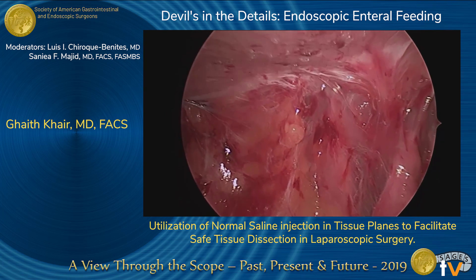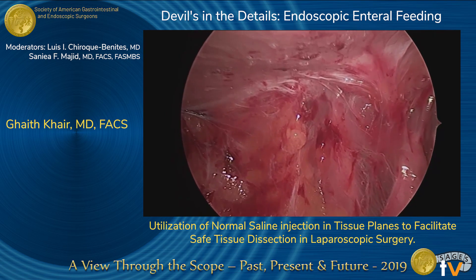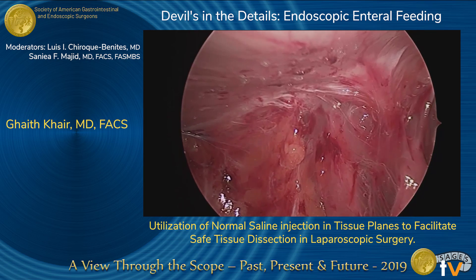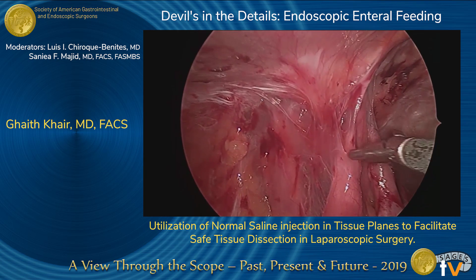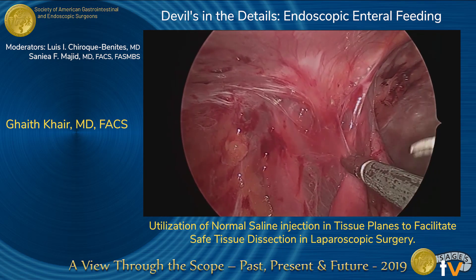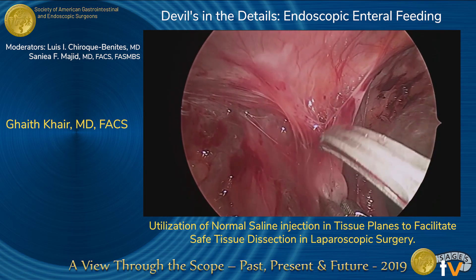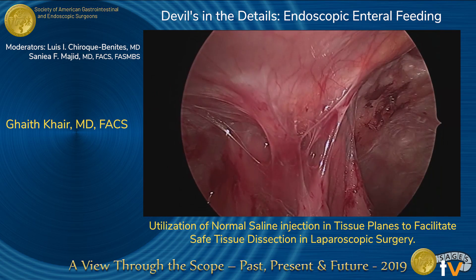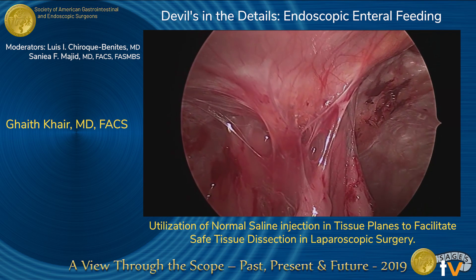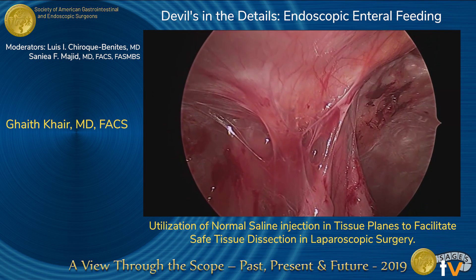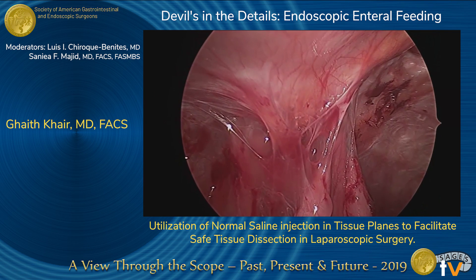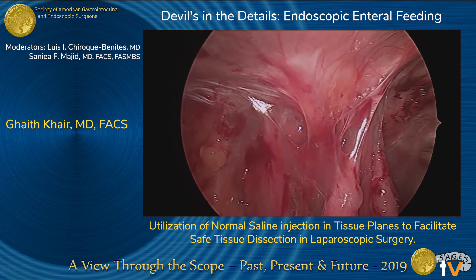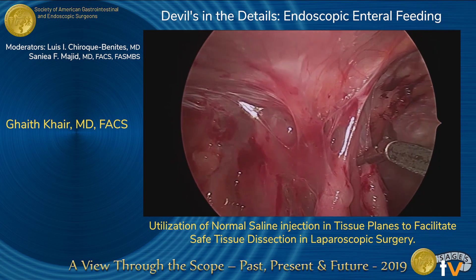We identify four different kinds of adhesions. One set of adhesions where this technique is not needed is where either the omentum is attached to the anterior abdominal wall, or the adhesions are flimsy and are easily divided with scissors.